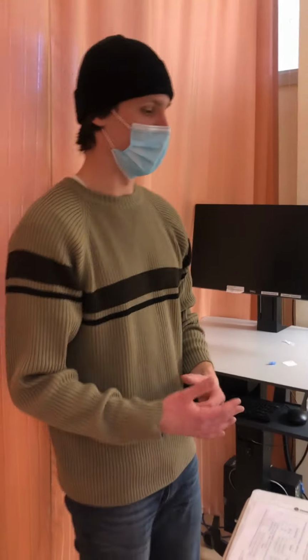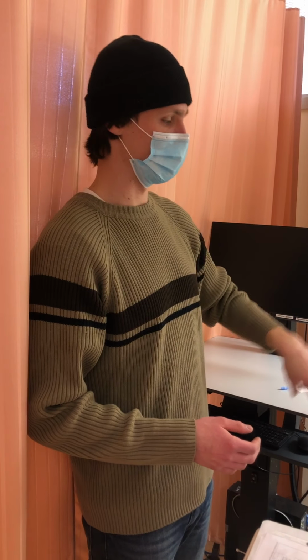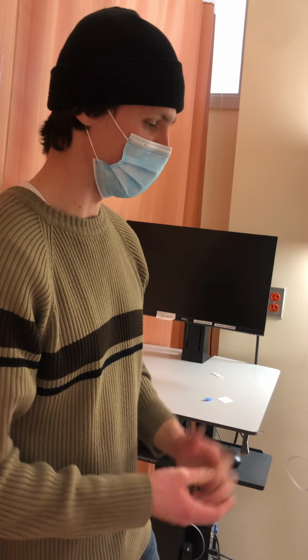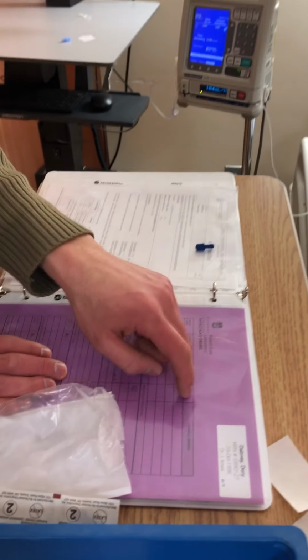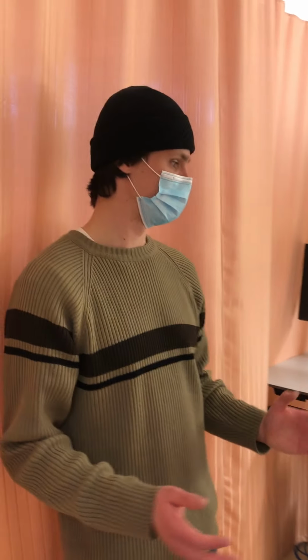So I'll inform them I'll be back shortly to just monitor the reaction to their medication. And also, once the medication has been fully infused, I will be back to make sure that the primary has started, and I will flush the secondary line with 15 cc's of normal saline. And yeah, so I ask if they have any questions. They don't. I do a safety check as I leave, make sure they have their call bell, their bed's at its lowest setting, and I'm just going to document here. I'm going to sign my initials and the time I administered this medication, and I'm good to go.